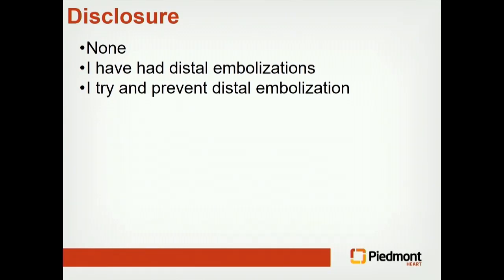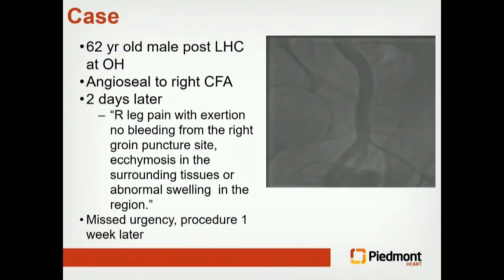I've had distal embolizations, and I try to prevent them because it really makes for a long day in the cath lab. So I'm going to show you a couple cases here, and perhaps appropriately to Subhash's statement about common femoral interventions. I got a 62-year-old who was post left heart cath at an outside hospital, Angio-Seal to the right common femoral. Two days later, he presented with these complaints. And you've got to be suspect with these calls.